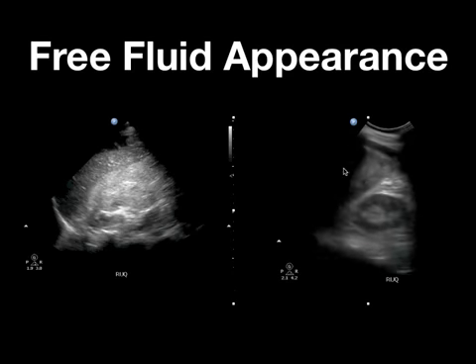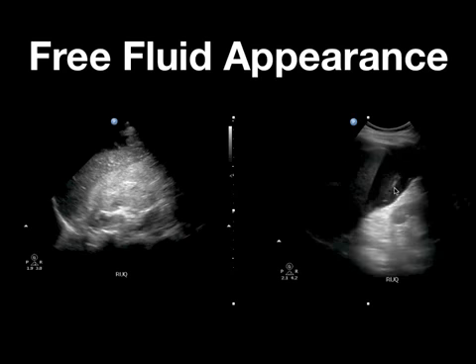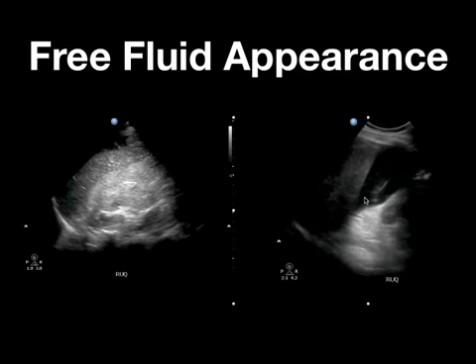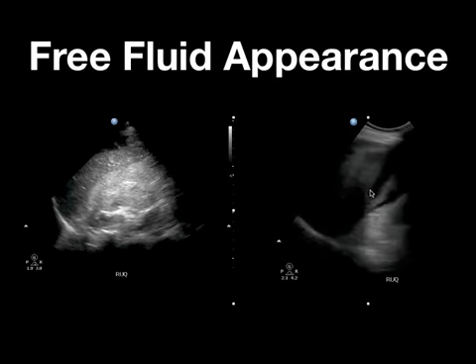Here's the patient with a large fluid collection in the right upper quadrant. You can see the gallbladder coming in intermittently. Here it was again a second ago. But you can see this complex fluid here between the liver and the kidney.